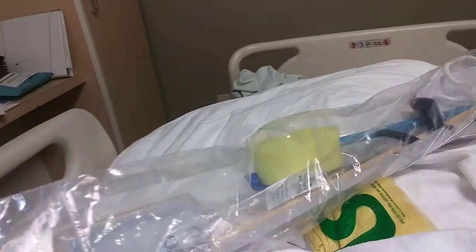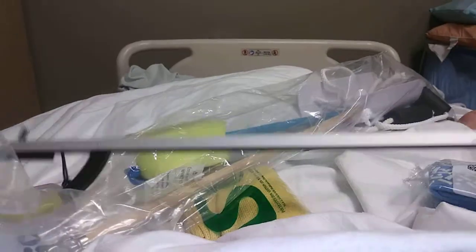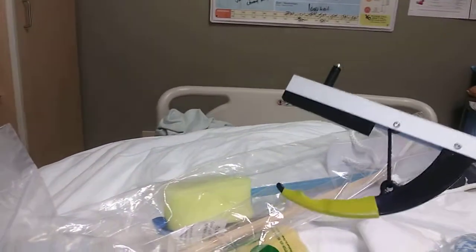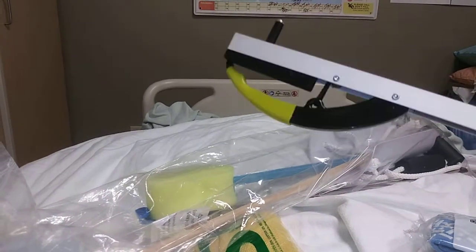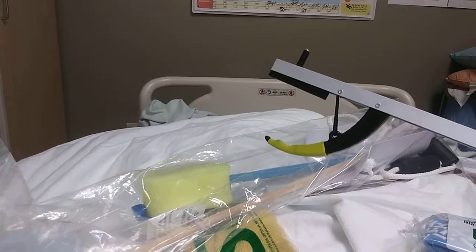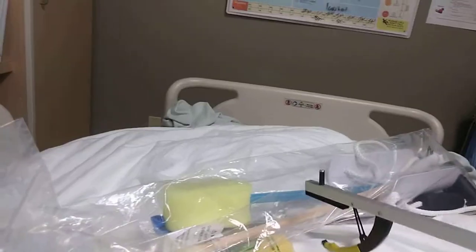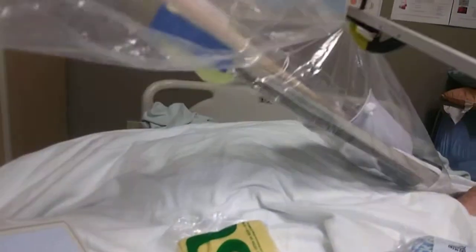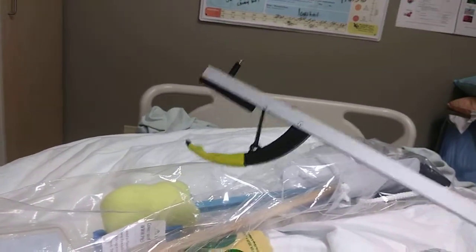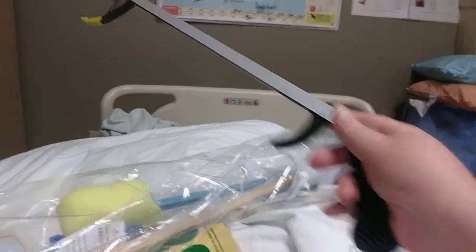The grabber. So the medical grabber has a rubber thing on the end there. See it? And that helps to grip on things and they don't slip out as easy as if it was just hard plastic. So it does a pretty good job. And I can even pick up this if I want. Anyways, it only holds 2 pounds of weight at any given time. Okay? Alright, that's the medical reacher grabber.